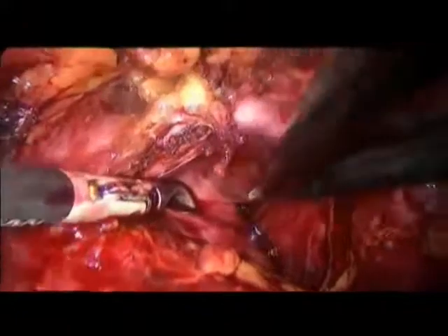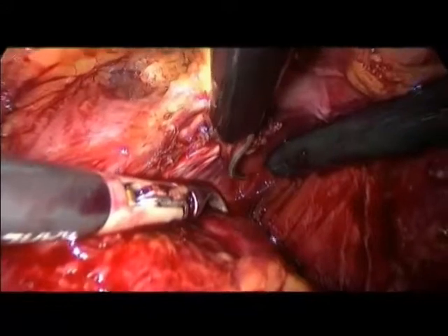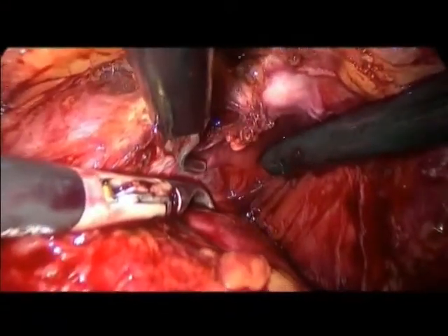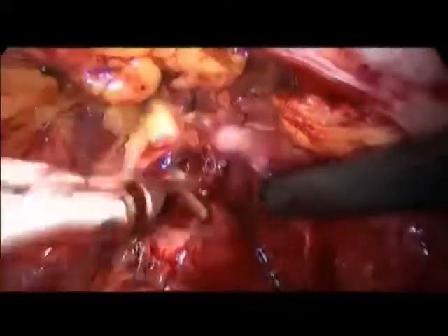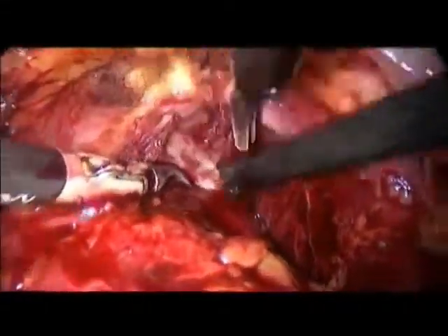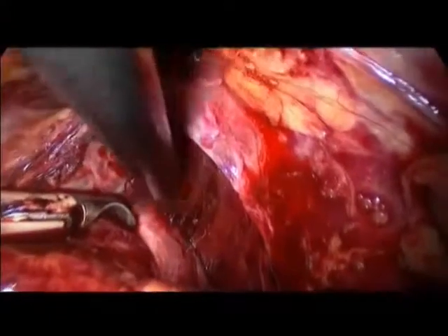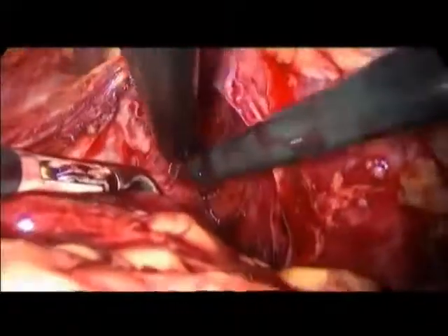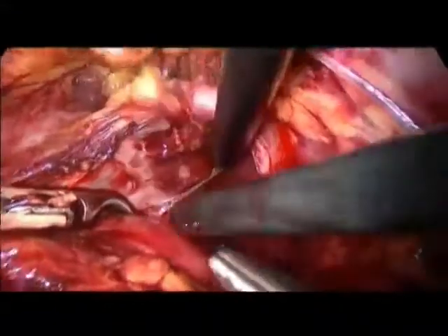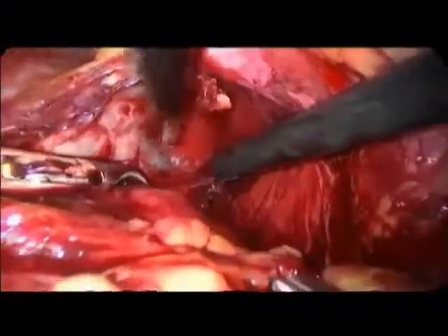Are you planning to put a stitch there? Not yet. We will do it differently as soon as we are happy with the dissection. So you see that the apex is still covered by the prostatic fascia, but we can proceed slowly to push away the sphincter and first the levator and then probably the pelvic floor muscles containing the sphincteric structures. But we are slowly progressing towards the apex.